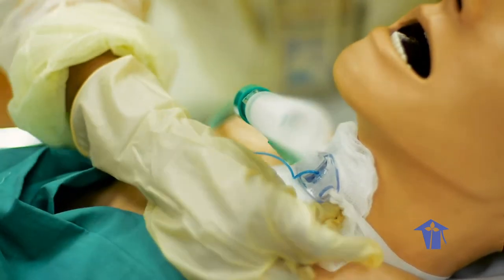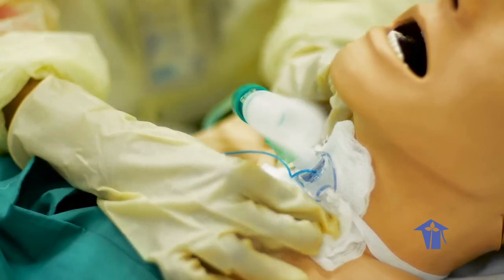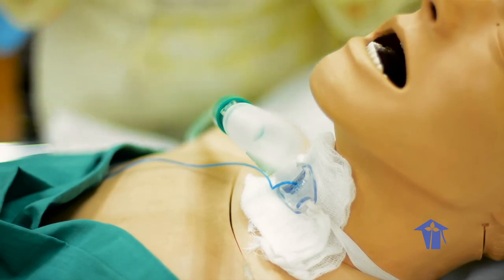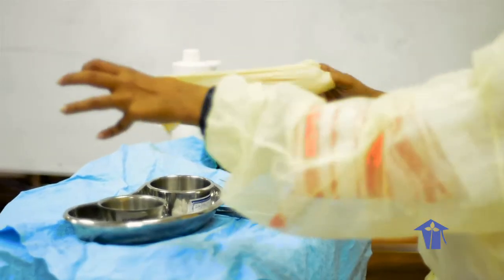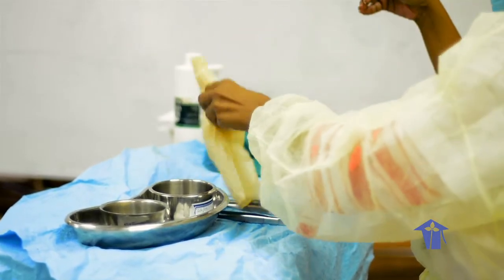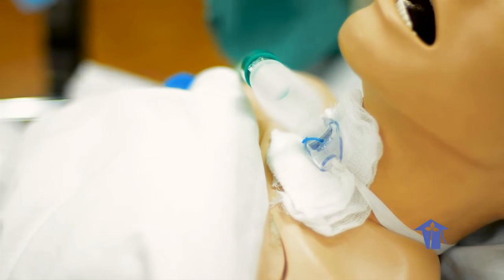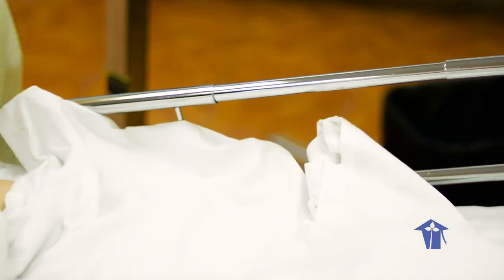Good. You'll make sure that your patient is comfortable with it. SpO2 is being maintained. Patient is showing no signs of distress. You would then remove your gloves and assist the patient to a comfortable position, raising the bed rails and placing the bed in the lowest position. I'm going to lift the rails up, all right?